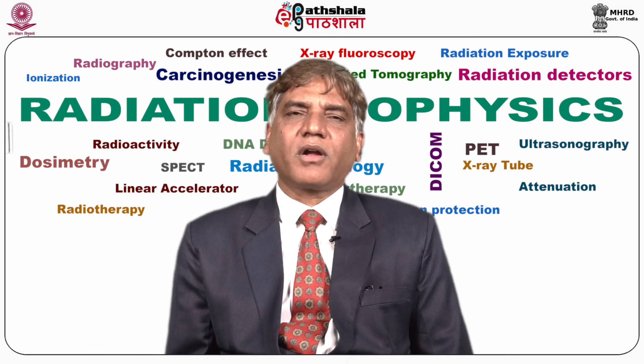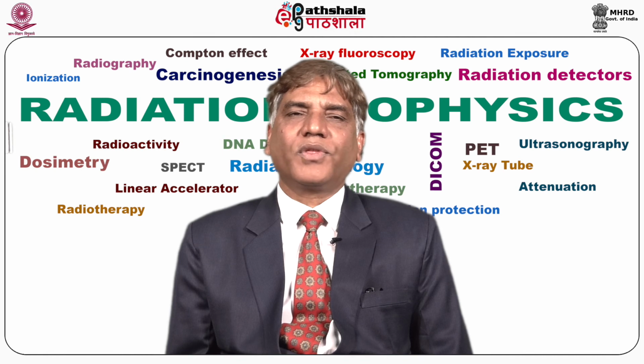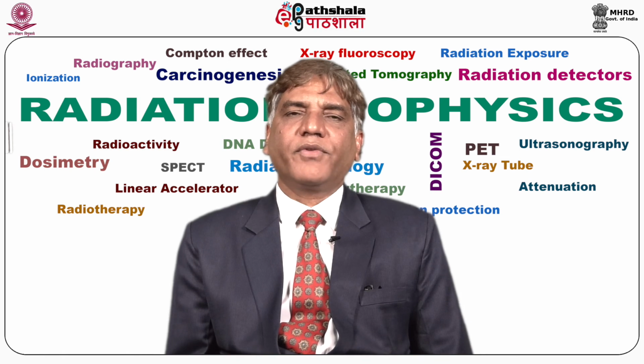This was the rotate type. That means both the X-ray tube and detectors rotate around the patient body in a concentric circle whose center approximately coincides with the center of the patient. It uses a fan angle between about 42° to 49°, and detectors were perfectly aligned with the X-ray tube.